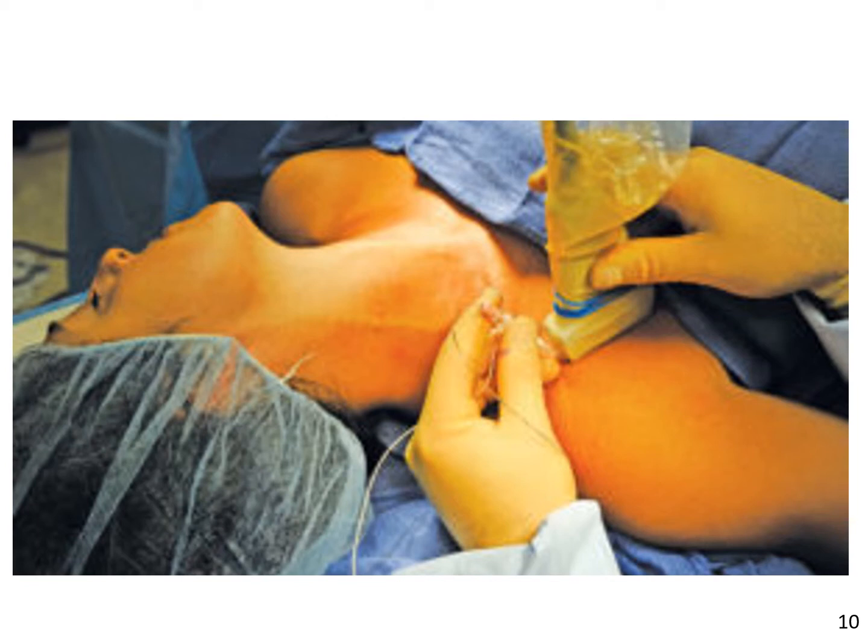The approach of the needle is just superior to the edge of the ultrasound probe. The needle is inserted in between the inferior border of the clavicle and the ultrasound probe, and this is advanced using an in-plane approach toward the target nerve.